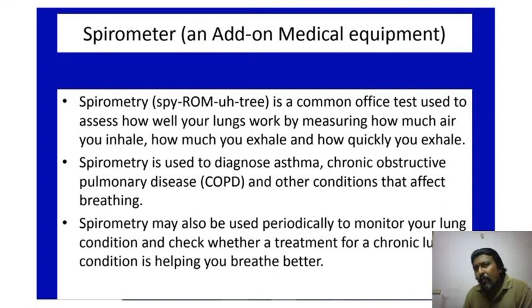Look, when you are going through some treatment, if there is a side effect that is going to affect your lungs, a spirometer can be used for checking that also, right? Whether your treatment is affecting your lung functioning or not, those things can also be checked.